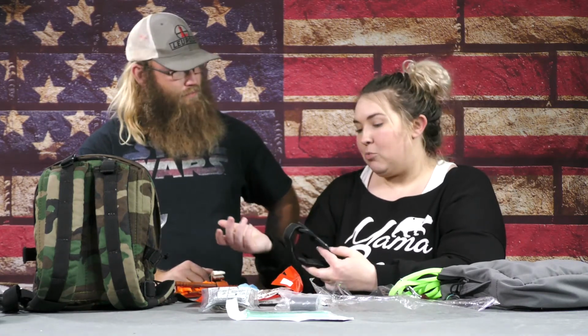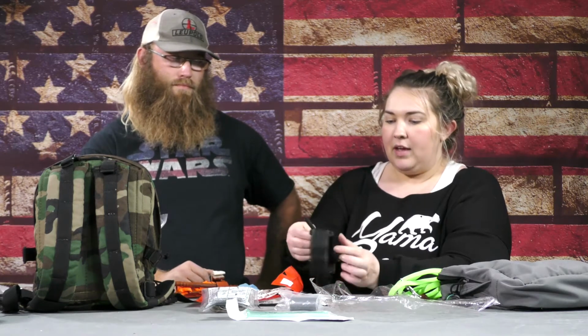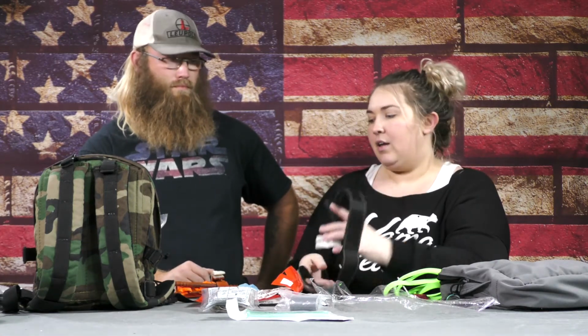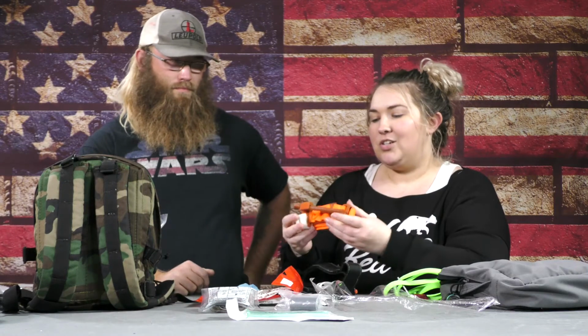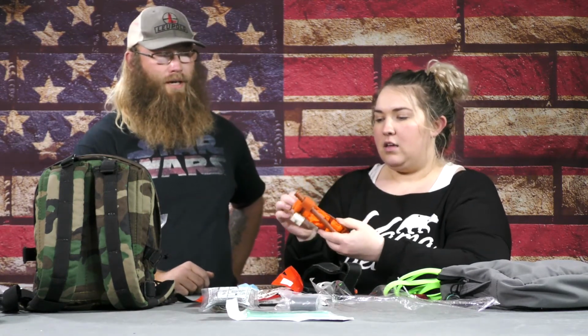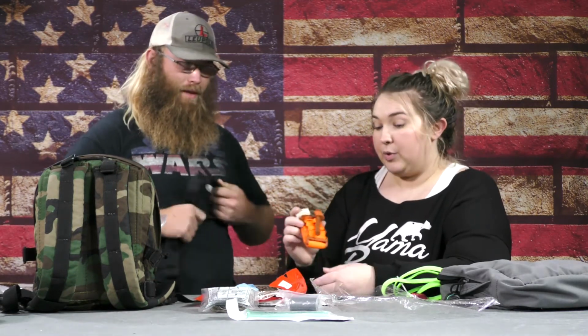Again, you can't buy them anymore, but because they had the metal right here, and then the buckles were good, I didn't have a lot of problems with twisting. They had this so that you could put your finger through there, and the cats just don't have that. This is plastic. They're twice the price too. Yeah, and they were twice as expensive, but they're still good tourniquets. Like they're really good tourniquets.